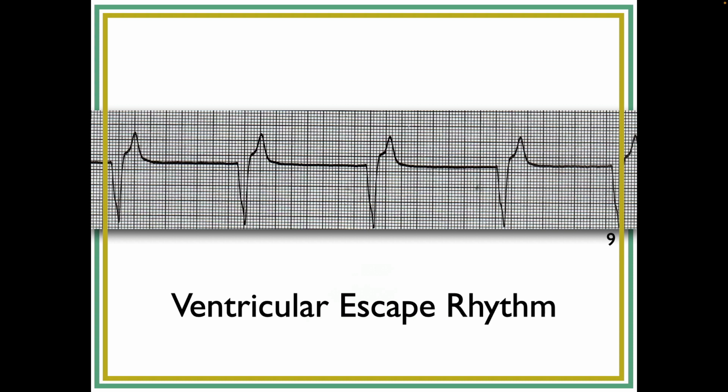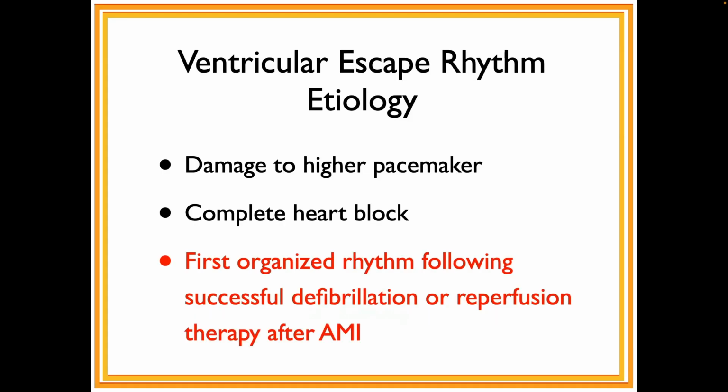Now, you're not likely to see a patient in ventricular escape with one exception. It's very rare that you walk in on scene and you put the monitor on and go, oh, look, ventricular escape. I can think of one time that happened, and it was a very unusual circumstance for me anyway, with the exception of complete heart block, but we'll get back to that.